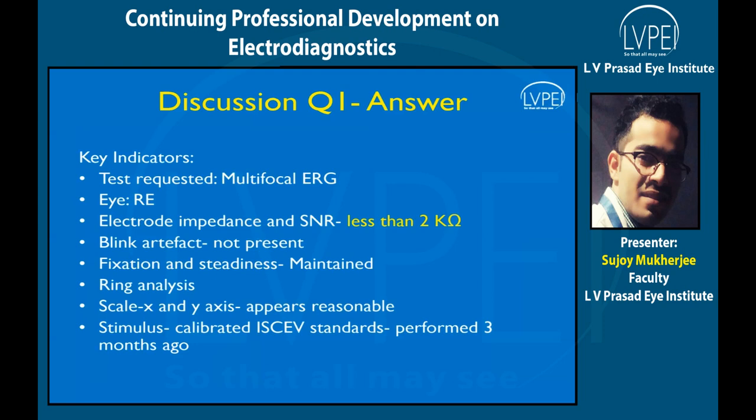Simultaneously, while the electrodes are in place and the patient is looking straight, or whether the patient blinks, we should always counsel or motivate the patient: yes, you are looking good, we have a few more minutes left. In that way, we can at least avoid some sorts of artifacts. Fixation and steadiness is very crucial.